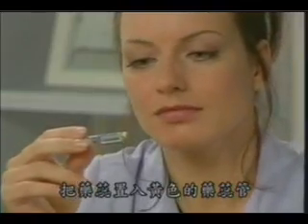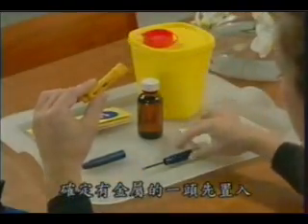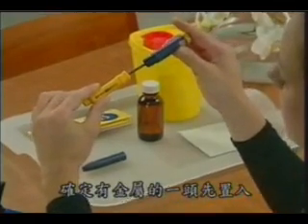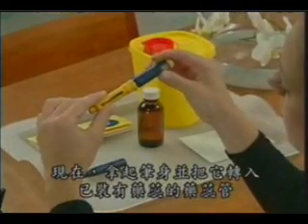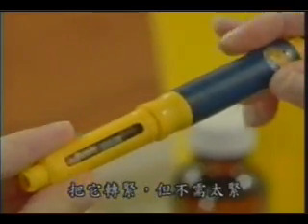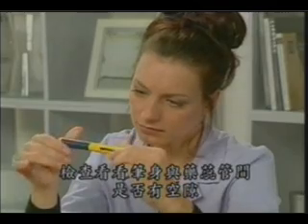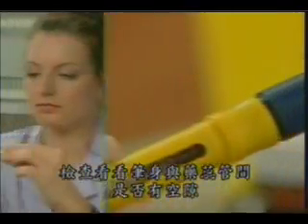Insert the Puregon cartridge into the yellow cartridge holder. Make sure that the metal cap goes in first. Now screw the body onto the cartridge holder with the cartridge in it. Tighten firmly, but do not over-tighten. Check that there is no space between the body and the cartridge holder.